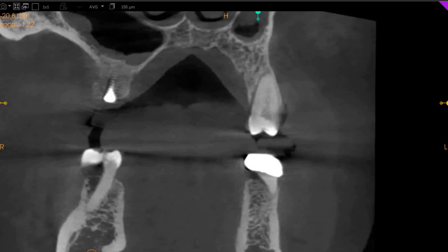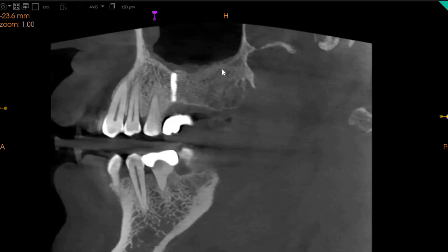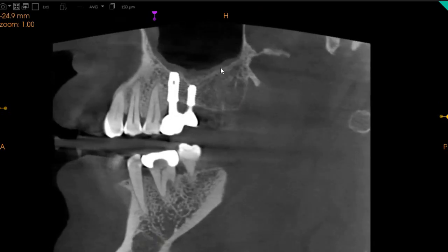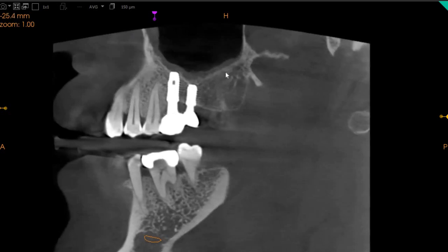The upper left five has a class 5 restoration from the buccal aspect. Again, this has one single canal. We don't see any radiolucencies, but we do see PDL widening on the periapical aspects. We check other views for any fractures. This is the upper left five — I'm going to zoom in for our doctor.